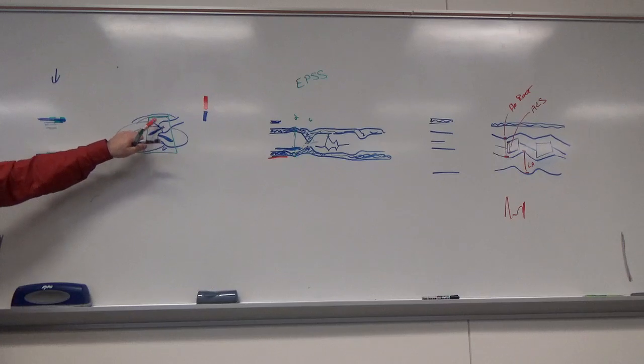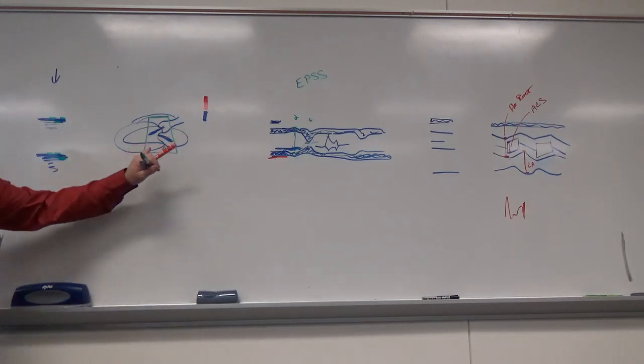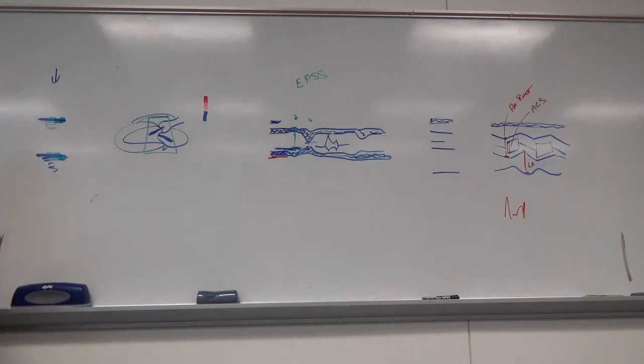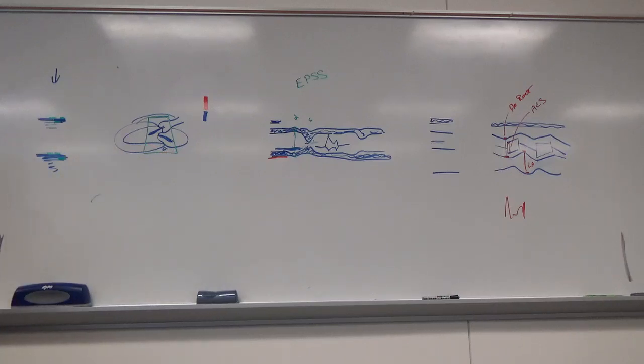I'm looking at these, but I'm also looking for holes in the wall and just the fact that things are intact and that we don't have masses and tumors and vegetations hanging off the valves and stuff like that. So we'll take a 2D clip of this zoomed image, and then we'll take a color clip of this zoomed image. Do you think we can Doppler this, spectral Doppler? No, why? The angle. Okay, very poor angle, so we don't spectral Doppler this. So now we've done our 2D clip, we've done our 2D measurements, scrolling and freezing in the right places. We've done our M modes, now we're doing this. That's all we need to do at this level. So now we're ready for the next view.